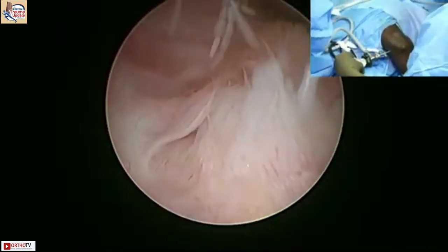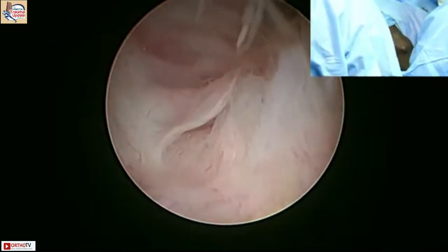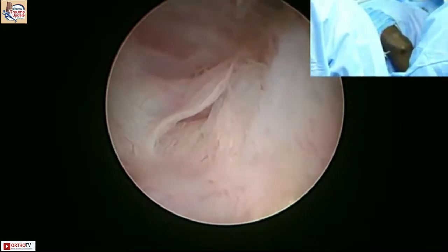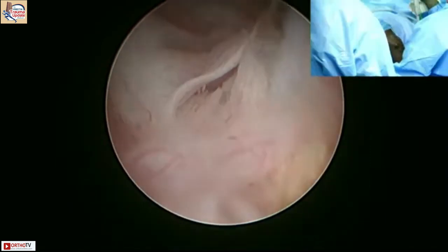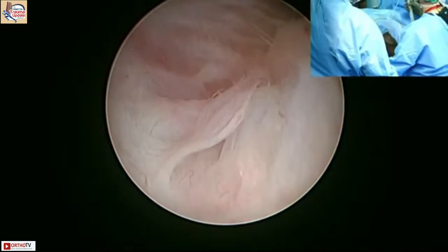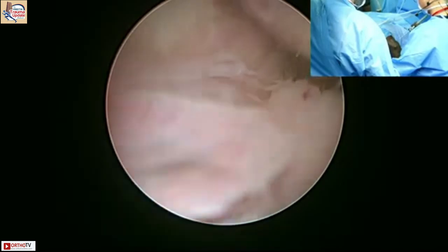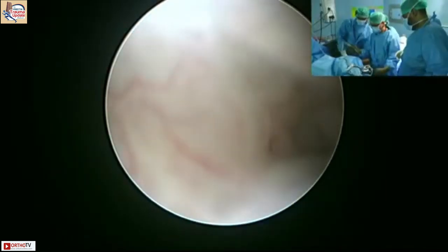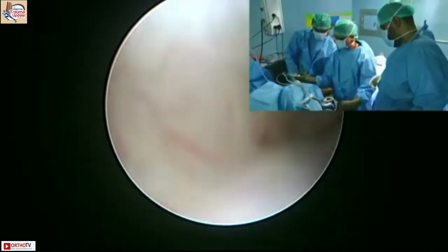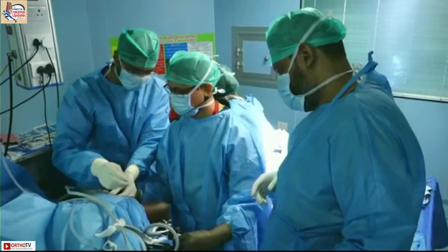Not in. It goes the other way as well. So Smith and Nephew is very, very tricky. What they've done is, for a small joint shaver, you need to have a different handpiece. You can't use the same handpiece. Can you make it foot control? No, it's only hand. Okay. Sorry, no problems. Make sure I don't press it.